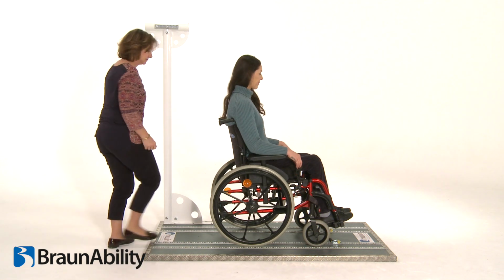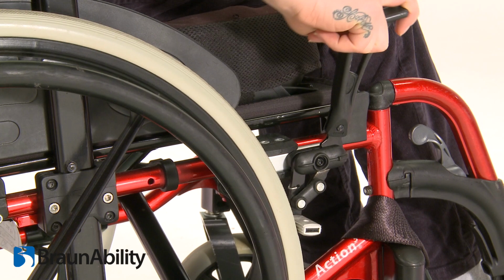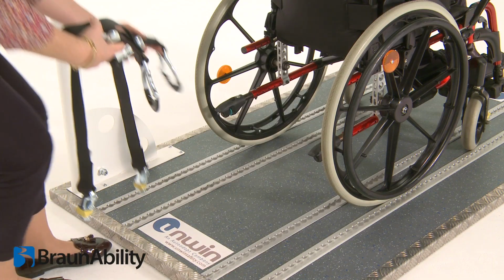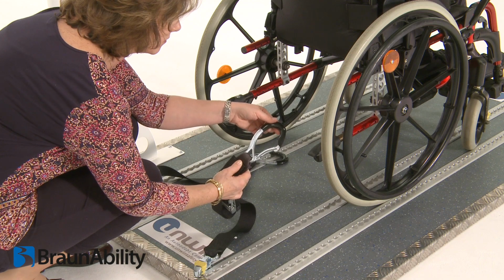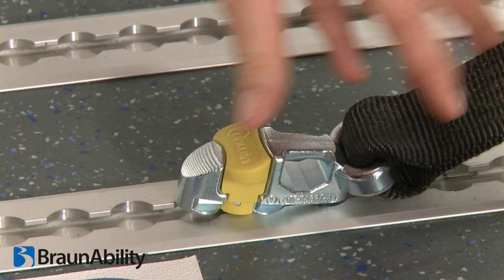Move to the rear of the wheelchair. Pull the wheelchair back to tension the front straps and apply the brakes on the wheelchair. Ensure the carabiner gates are facing outwards from the wheelchair main frame. Fit the rear straps into the rail, ensuring the clip is fully engaged.